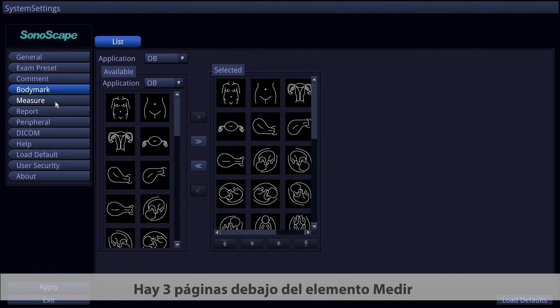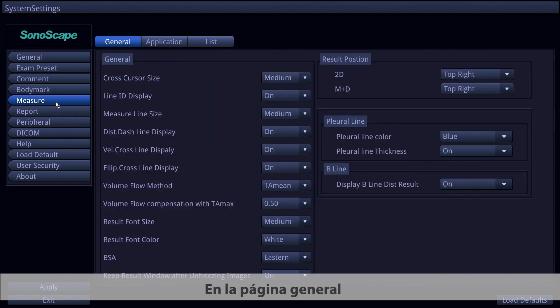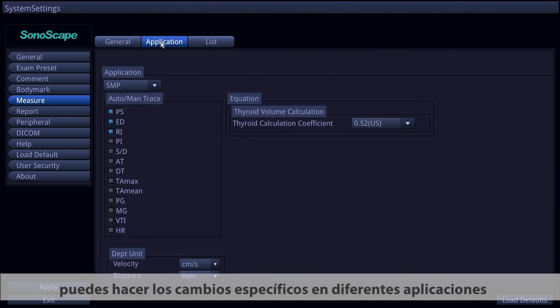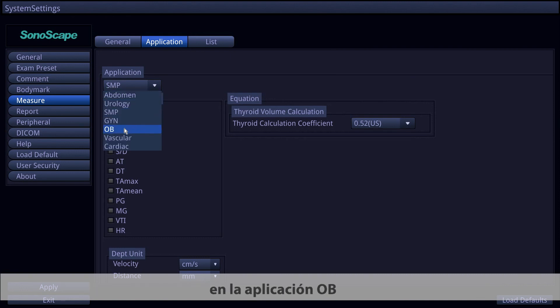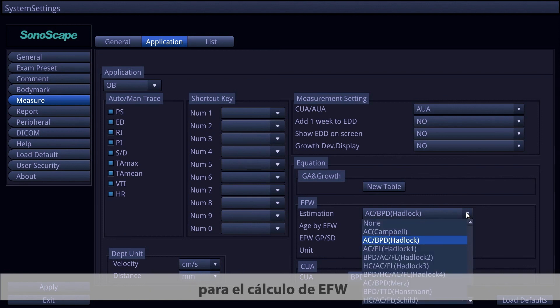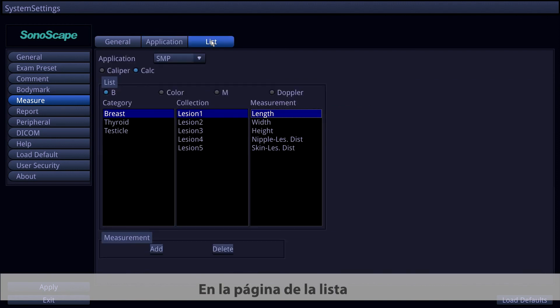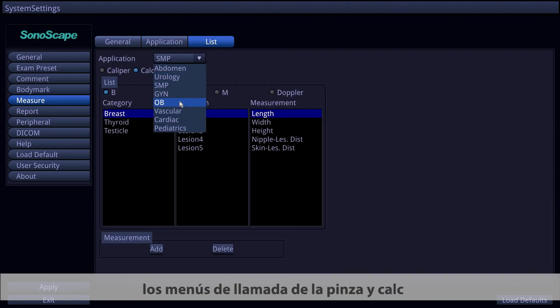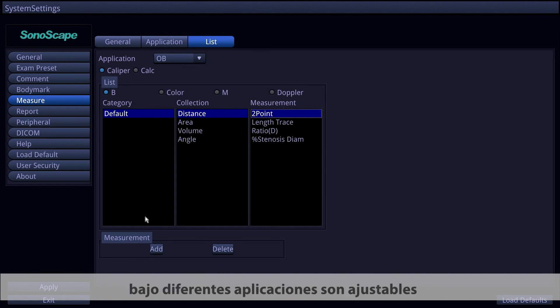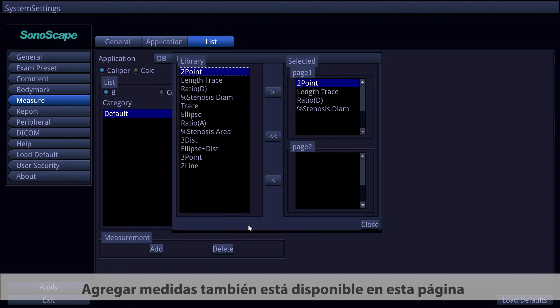Under the Measure item, there are three pages. The General page covers universal settings for measurement elements and result positioning. The Application page allows specific changes per application — for example, in OB application you can choose different estimation methods for EFW calculation. The List page allows you to adjust caliper and calculation callout menus under different applications, and adding new measurements is also available.